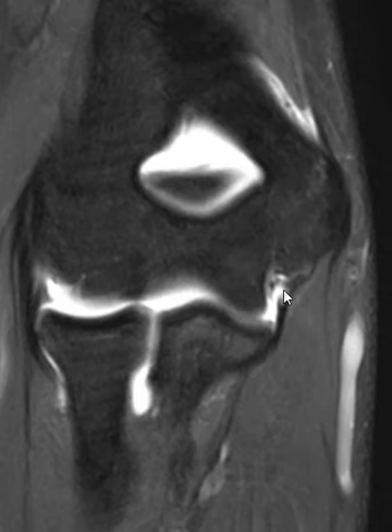As we come up here, we see the UCL fan out. The posterior band is more of a fan — broad configuration — and it attaches on a horizontal portion of the distal humerus here. It can be really hard to tell if this is torn or not, because it fans out and there's a bright signal in it pretty regularly. But I believe this one is partially torn — the posterior band.